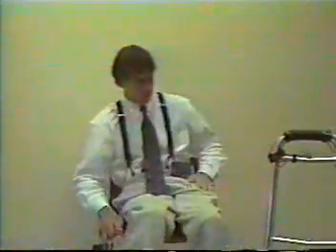This video shows a functional electrical stimulation system that allows traumatic complete paraplegics with a complete severance of their spinal cord at anywhere between the T1 and T12 levels to ambulate short distances independently and without braces. This system received full approval by the FDA, the Food and Drug Administration of the USA, in 1994, and it is presently commercially available. It was the first and is still the only system to have received FDA approval.